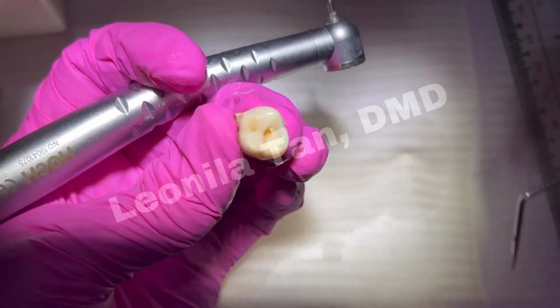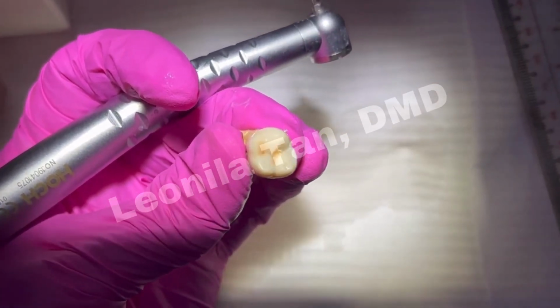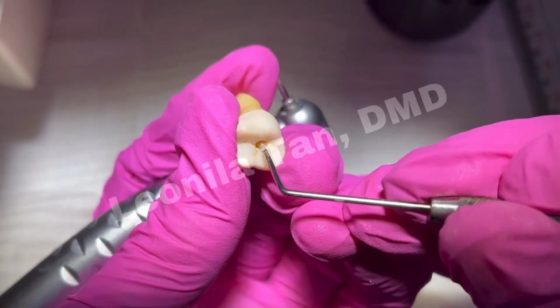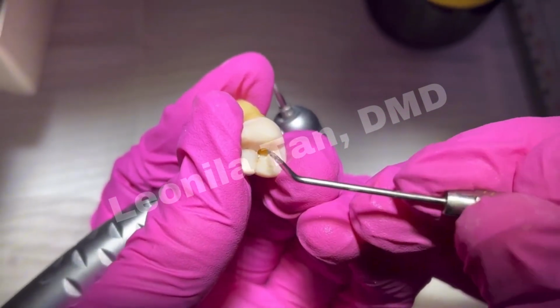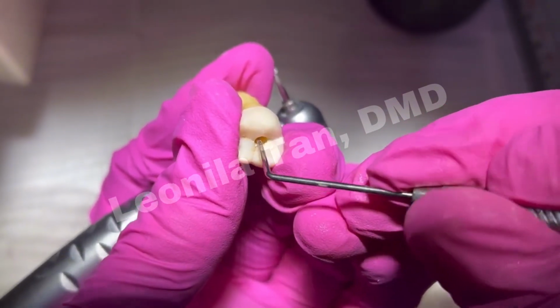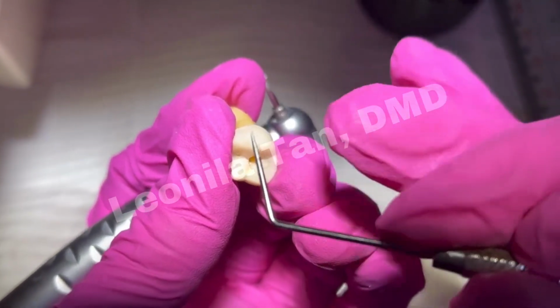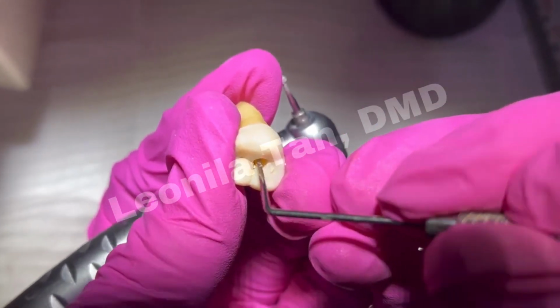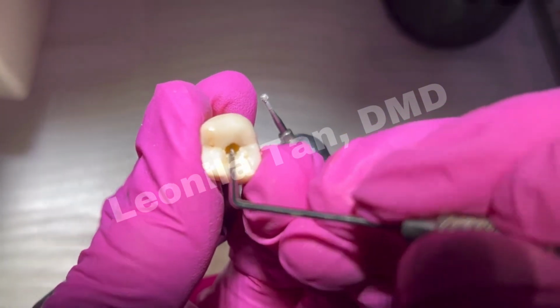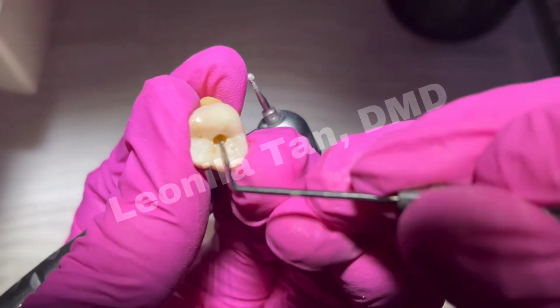Then check with your Explorer. Always check with the Endo Explorer, because once you feel that there's an area that is thinning out and the Explorer wants to go in that direction, again, always check that your orientation is still correct.